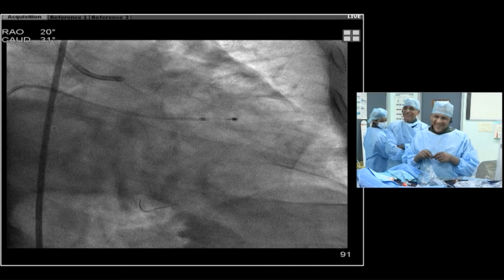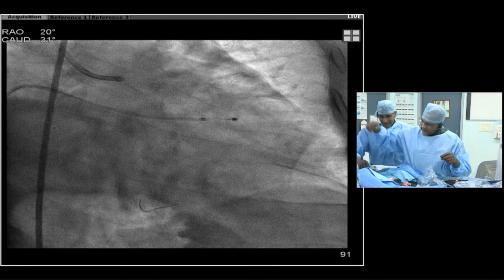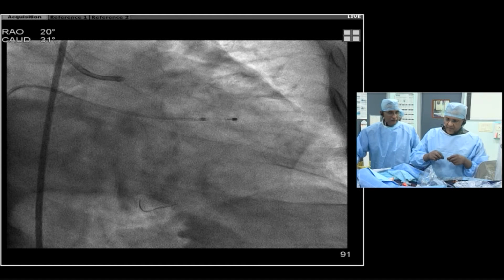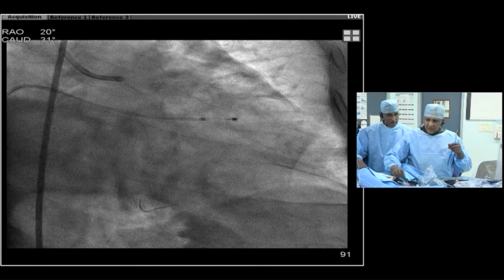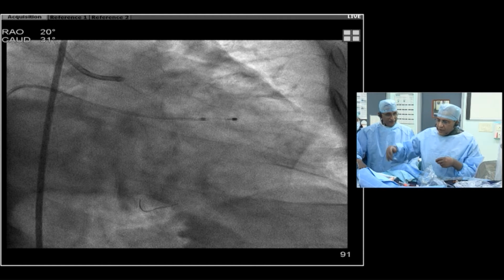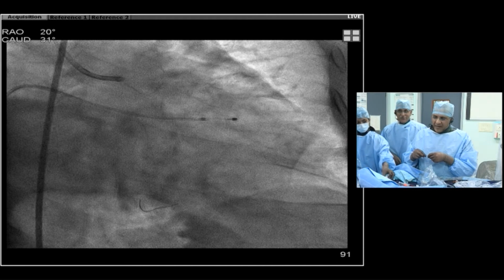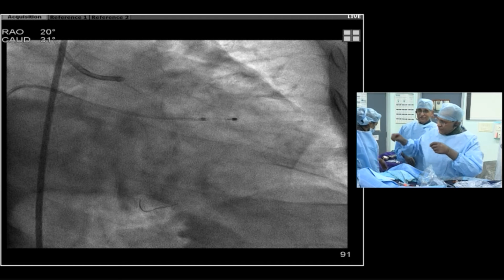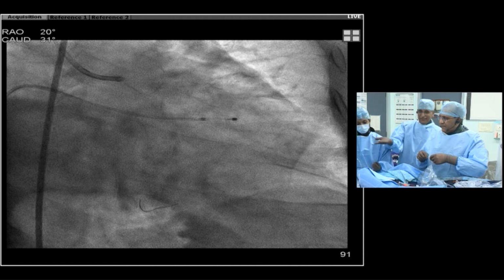So Kirti, tell me again. So this is a short wire, and you walk the microcatheter out without trapping it. It's a long wire. It's a normal rotor wire. It was a run-through wire on which I just ran through, and then I just removed that and I did my rotor wire. I just push my rotor wire. As my rotor wire goes forward, see, the rotor wire is 260 centimeters, so it is easy to remove.